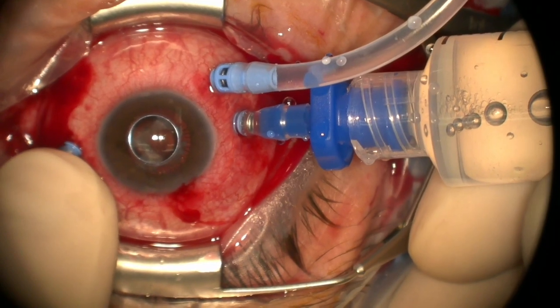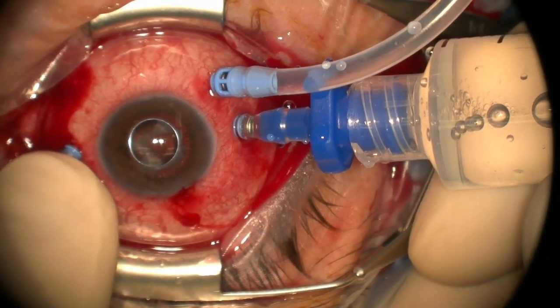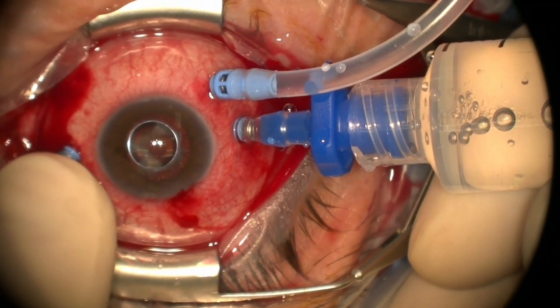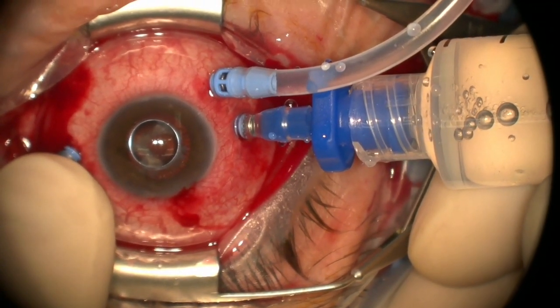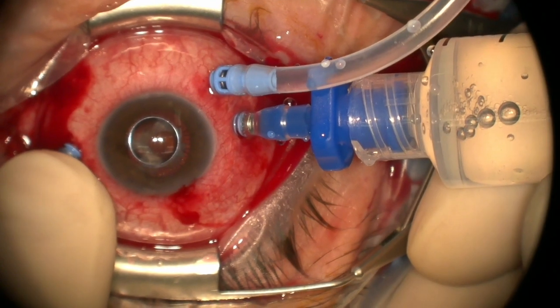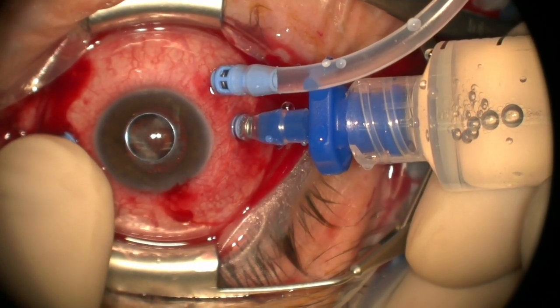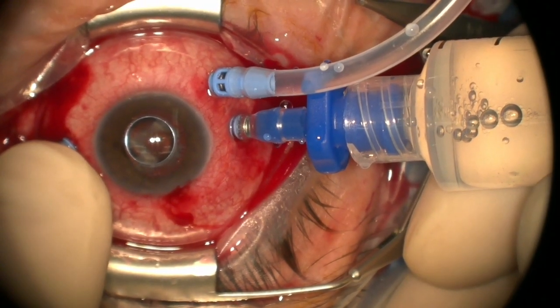But I do like the idea of putting in the sulcus the way they left the anterior capsule there. We're going to open that up a little bit so it's not such a tiny opening to look through for our surgery, but should be able to leave the anterior capsule intact to the point that we can put a sulcus-based PCIOL in there at a later date.